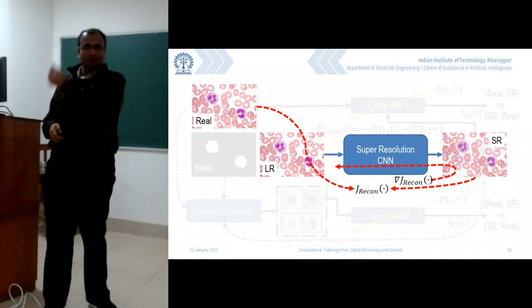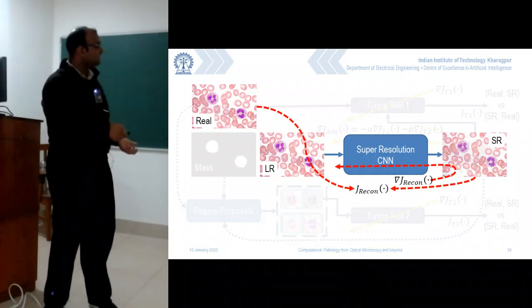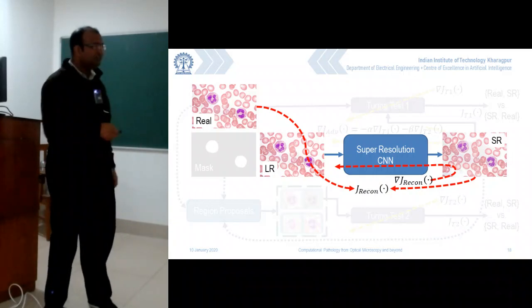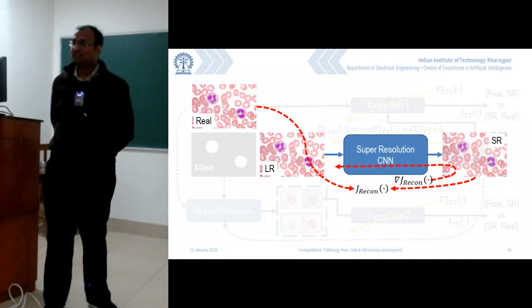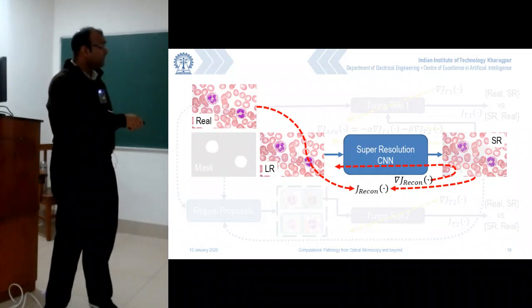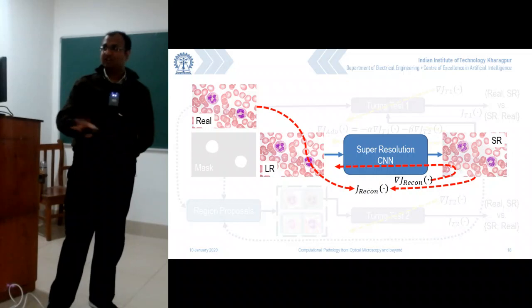If I take a sum of all the zeros in a matrix, that is also going to be 0. So in my best case, this error is supposed to come down to 0. And that error is what is mathematically defined as something called a reconstruction error, J-recon. Now there is some part of the error which needs to be fed to this CNN in order for it to understand. Initially it will not have all that reasoning properly ingrained in it.